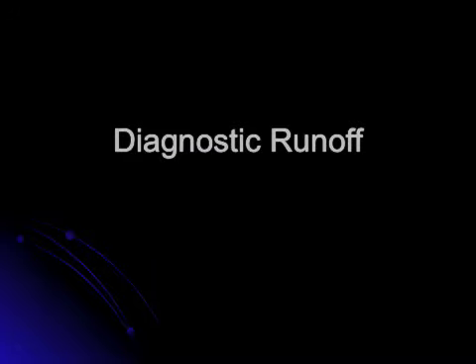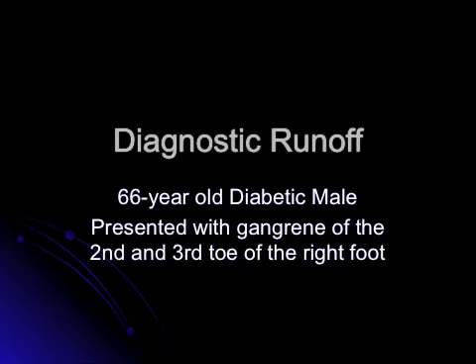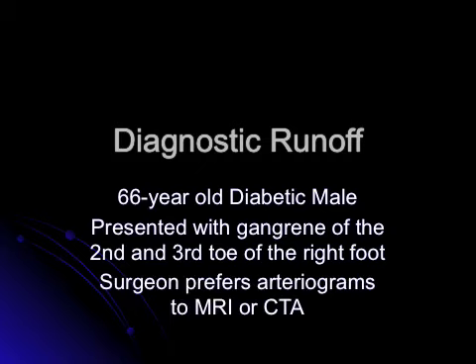This is a 66-year-old man who presented for a diagnostic runoff. He is a diabetic and has gangrene of his second and third toe on his right foot. Our surgeon requested the arteriogram to evaluate him prior to performing a bypass graft. He prefers diagnostic arteriography to MRI and CTA.